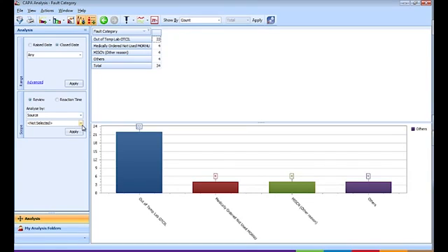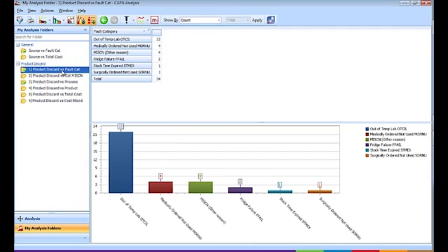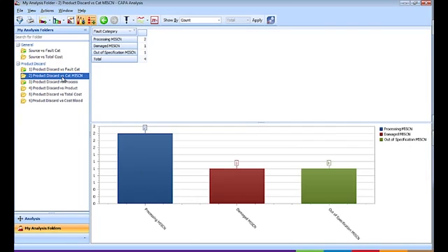the same data sets. Okay, so what we're also able to do is create searches that can be shared with other users, so they do not have to build their own searches. And so on a daily basis they can click into, with one click, product discard versus fault category. They can then drill down into category miscellaneous and see what the subsets are.